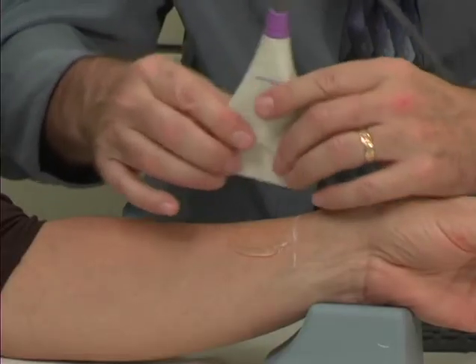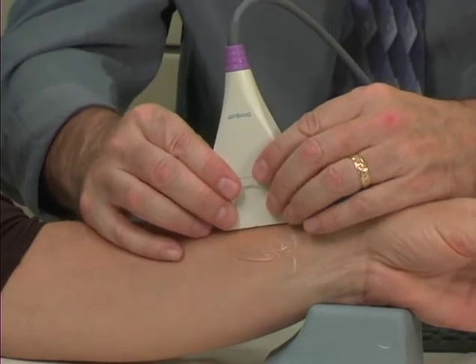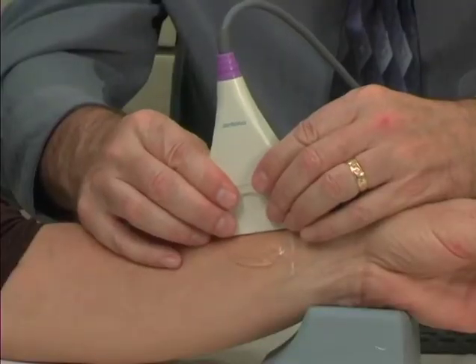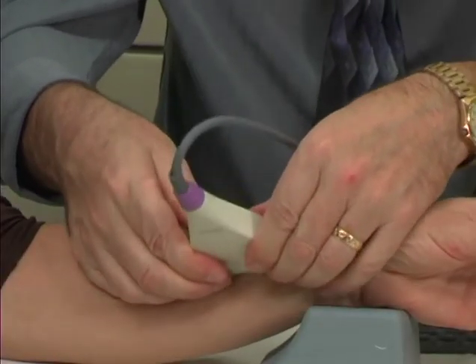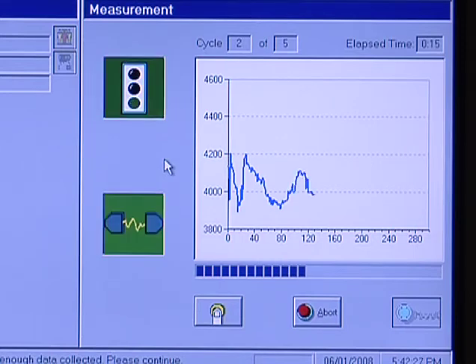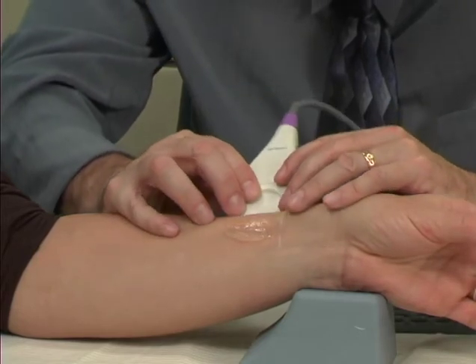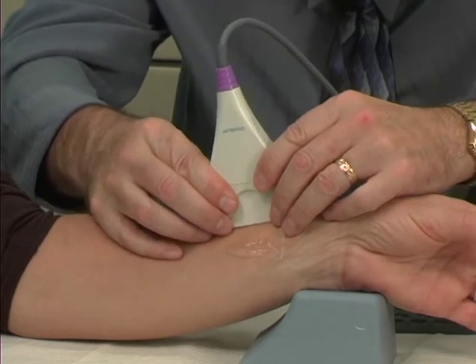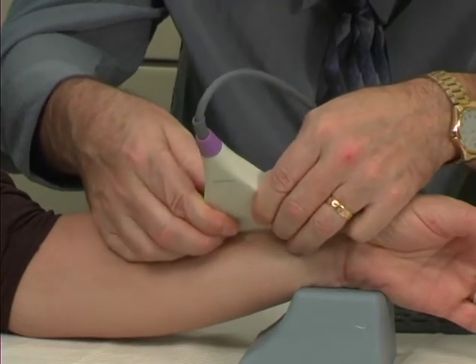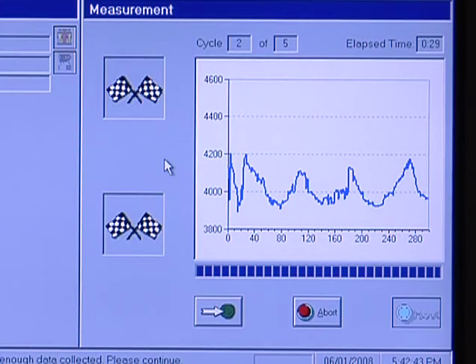This is the time where I can check to make sure we still have enough gel. Now we're going to start the second cycle — I'm going to kick the foot pedal and you'll hear the same again. So let's do that. We start again, performing another five-second drag across the site. There, we've gone to the end of the second cycle.